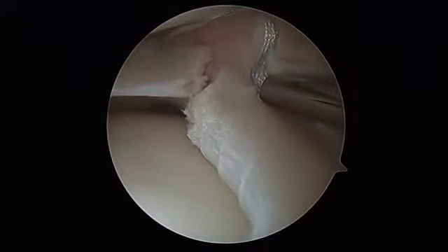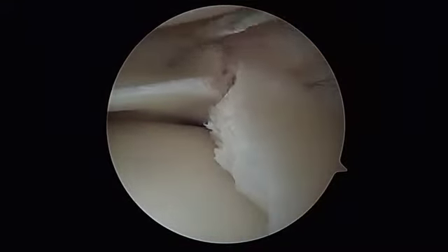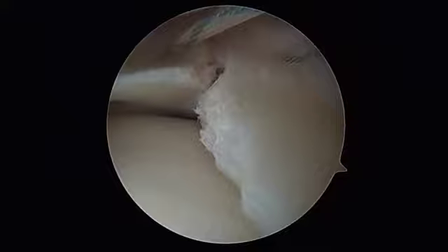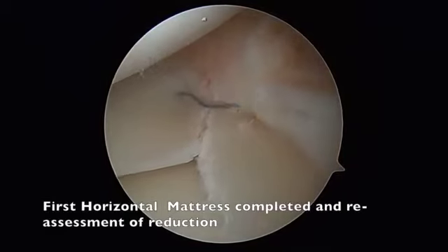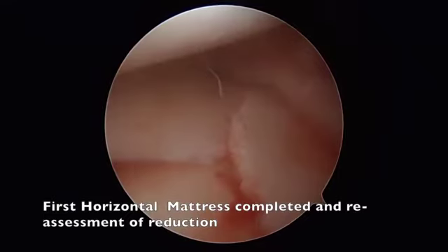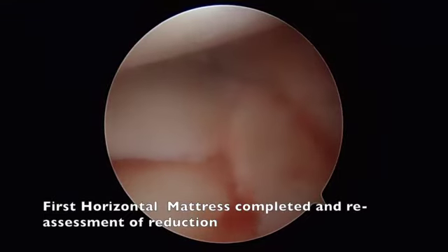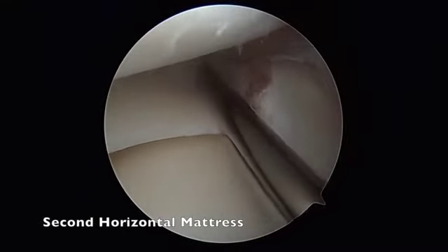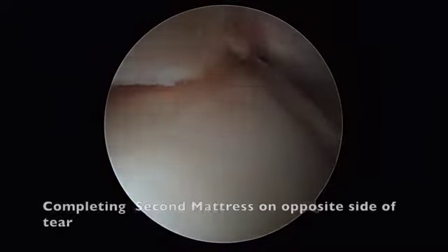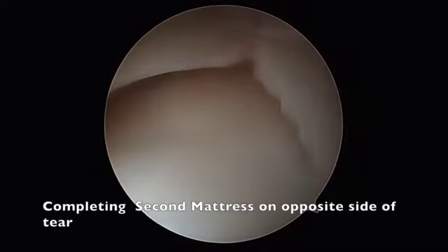The slack is then taken out of the suture, which should confirm the likelihood of a successful repair. A second 2-0 mini-suture tape meniscus repair needle is then introduced through the zone-specific cannula in the anteromedial portal, and a second horizontal mattress is completed in the identical manner to that previously described.